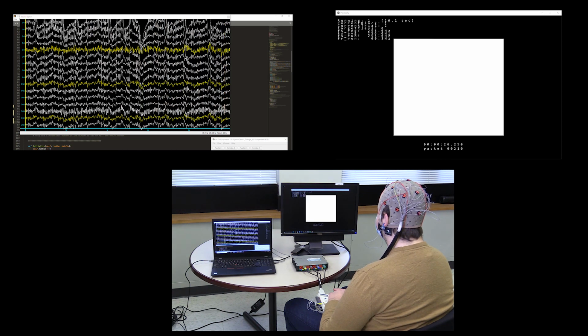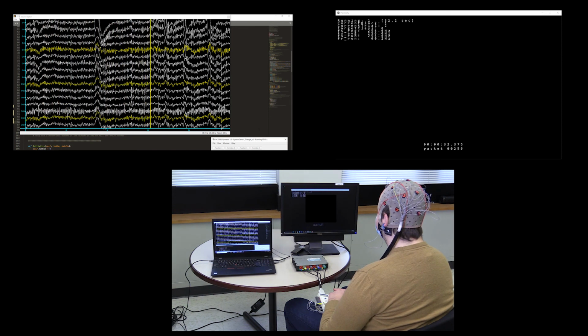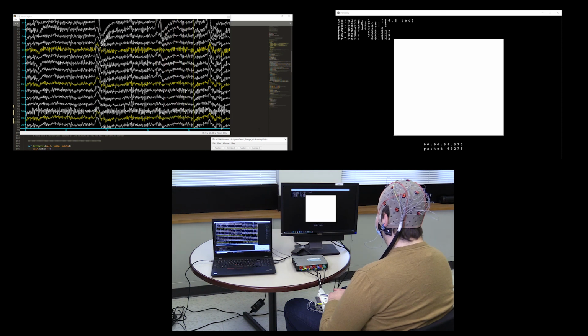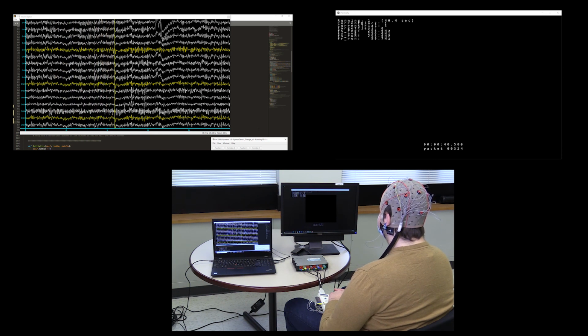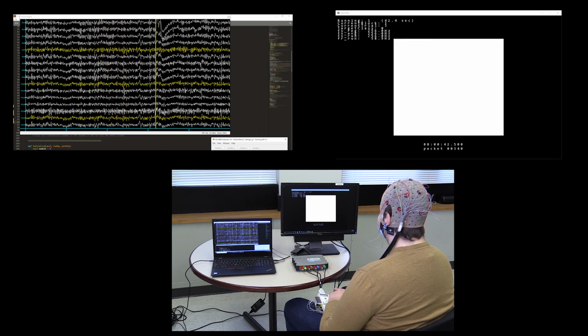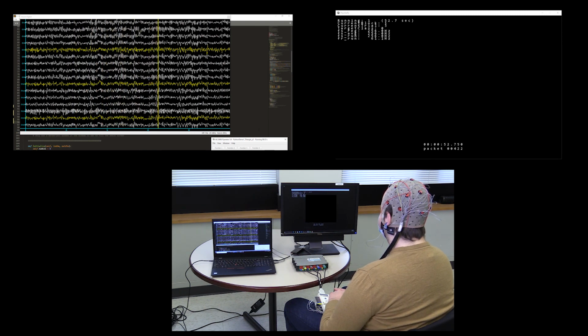The subject's raw brain signals are acquired through the gUSBamp amplifier, which are then displayed on the left screen. Then this source is passed to the Python signal processing module, which, for the purpose of this experiment, simply passes the data to the application. Meanwhile, the application module is displaying the stimuli. Here we have a demonstration of BCPy2000's modularity and resultant flexibility.